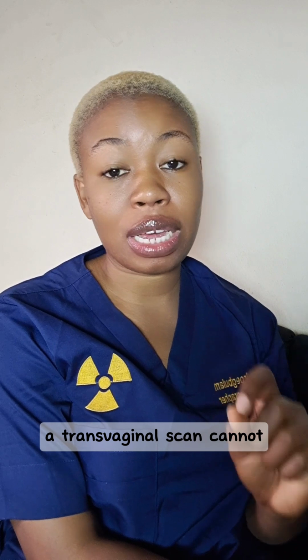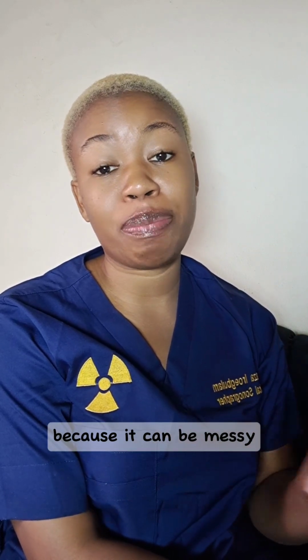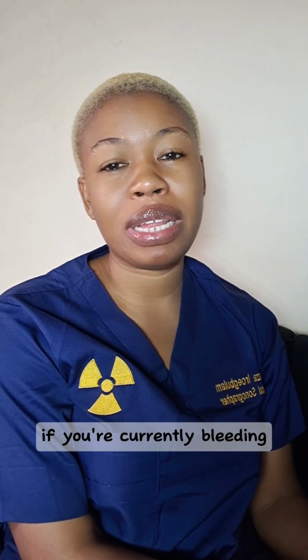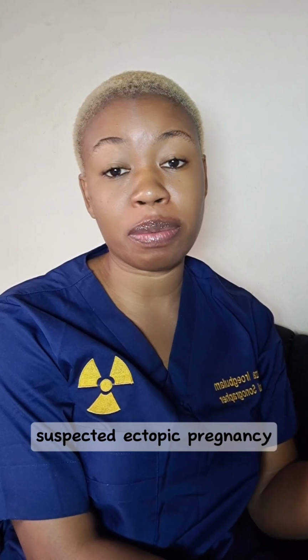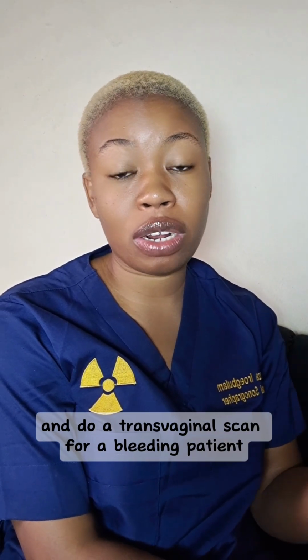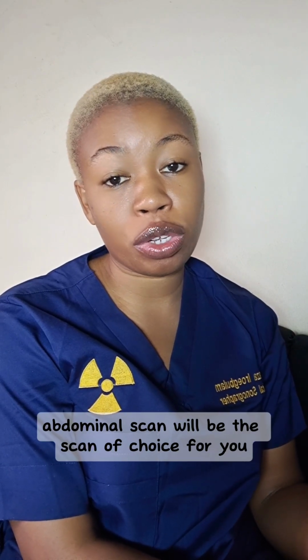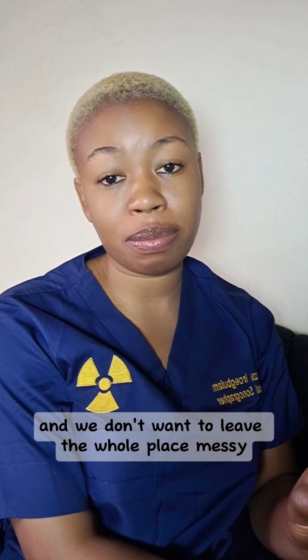Lastly, a transvaginal scan cannot be done on a patient who is currently bleeding because it can be messy. If you are currently on your menses, if you're currently bleeding, except in cases of suspected ectopic pregnancy, then we can go ahead to defy the odds and do a transvaginal scan for a bleeding patient. Other than that, if you are bleeding, a transabdominal scan will be the scan of choice for you, because a transvaginal scan requires insertion and we don't want to leave the whole place messy.